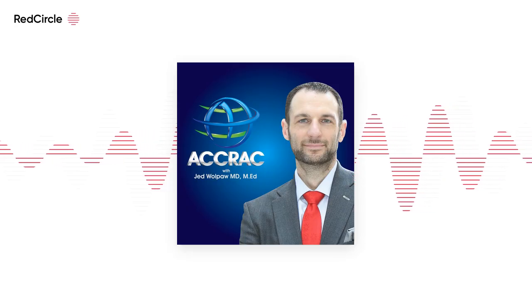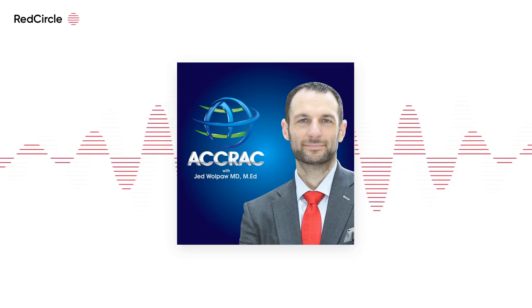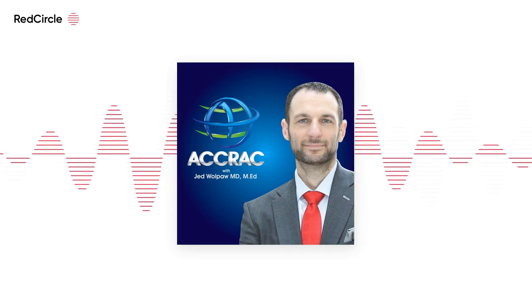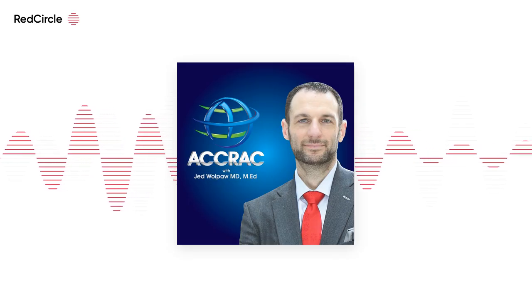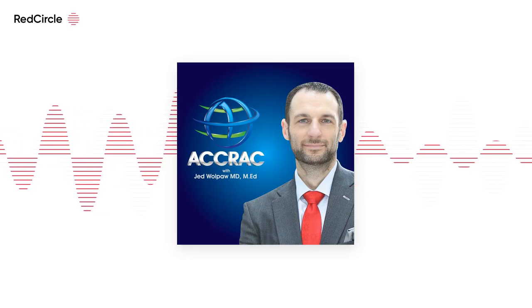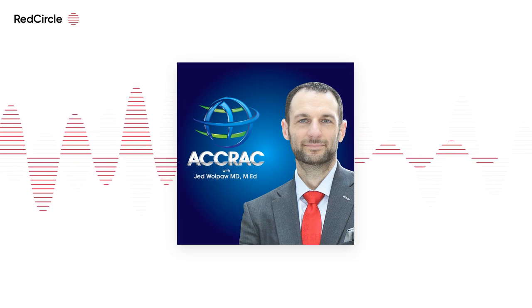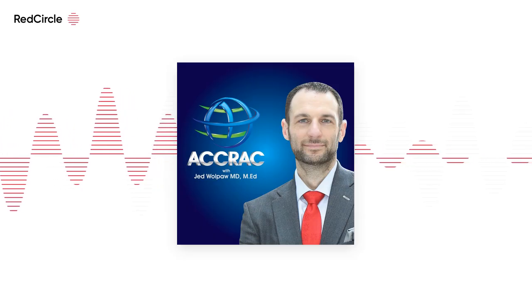And the whole idea of doing this decrementally is that it's faster, because pressure and time always are a balance in recruitment. You can recruit at a higher pressure very quickly or at somewhat lower pressures with much more time. But de-recruitment is fast. You drop below that collapsing pressure for a certain balloon and it flattens out. So if you start high and go down, you should be able to pretty quickly see when compliance changes and some de-recruitment occurs. Whereas if you go up, then you would need to wait much longer at each point because you've got to wait for recruitment.